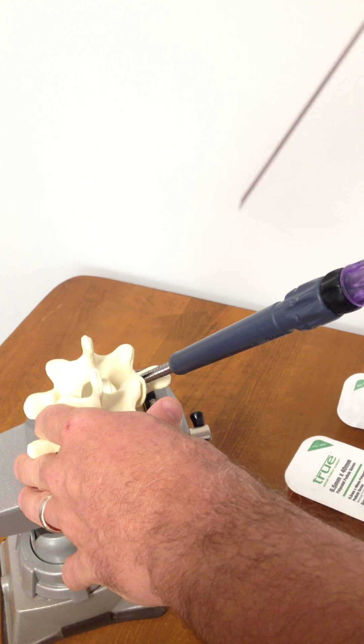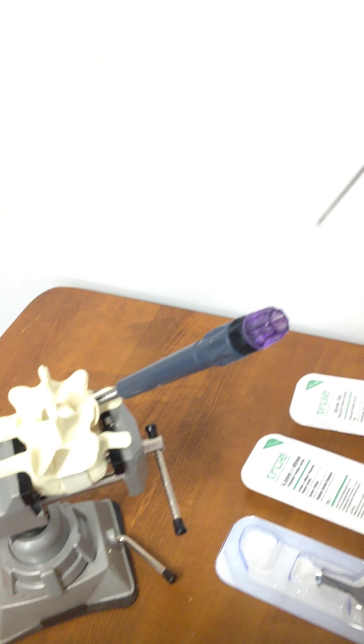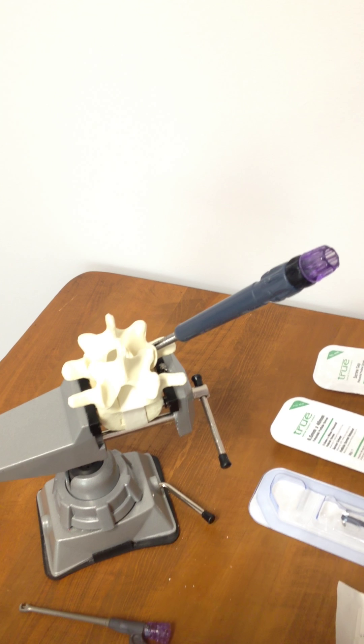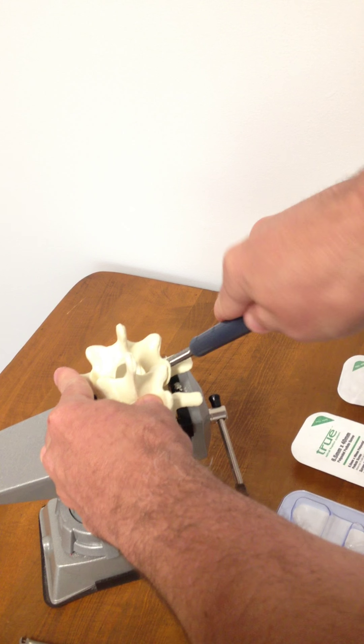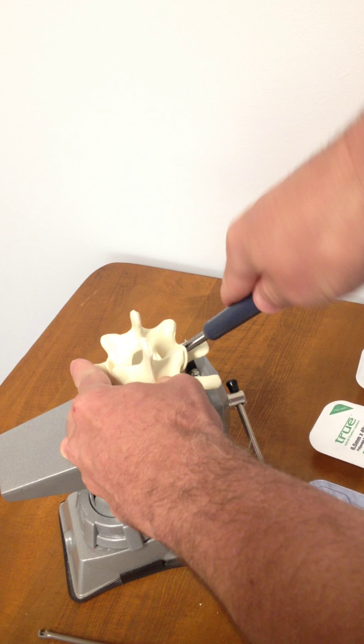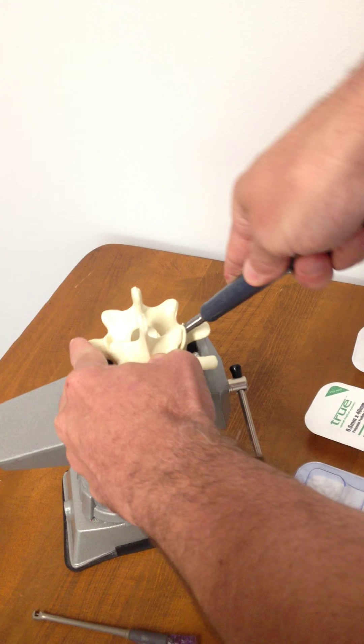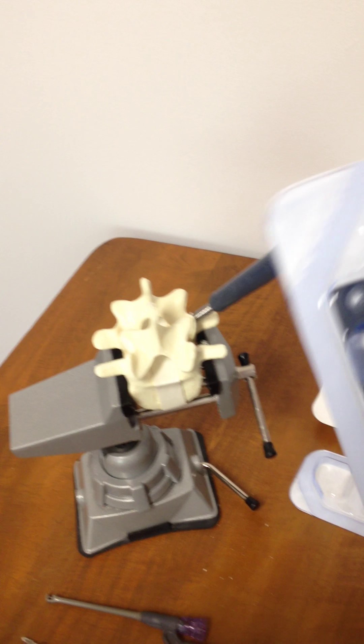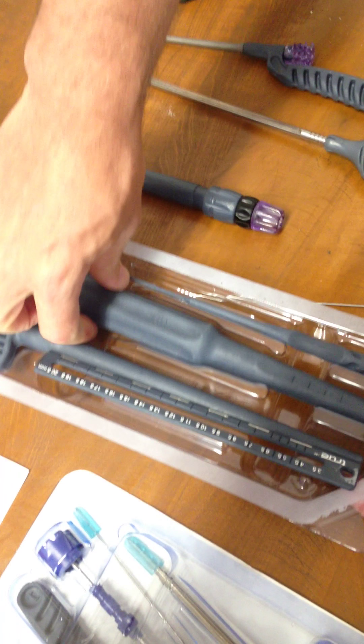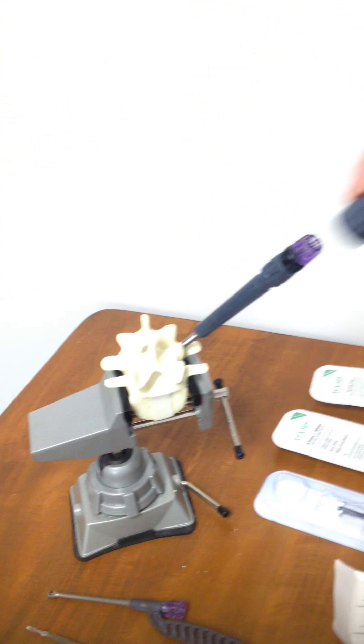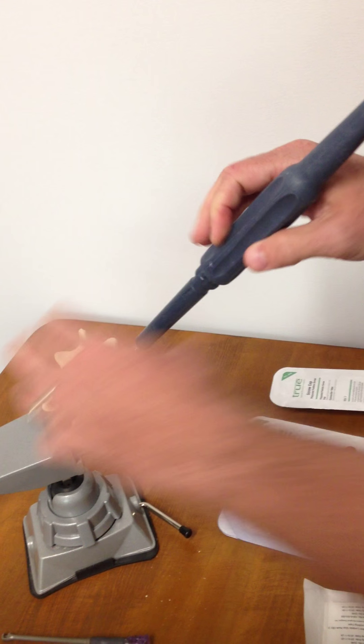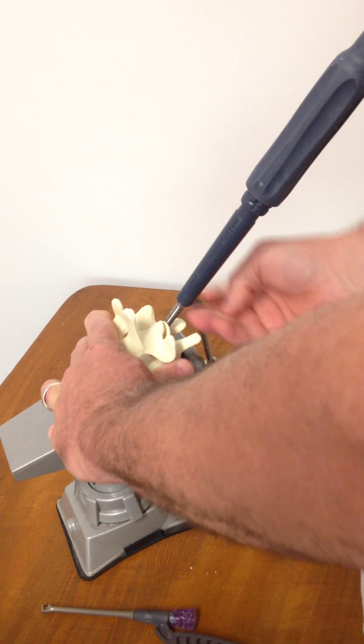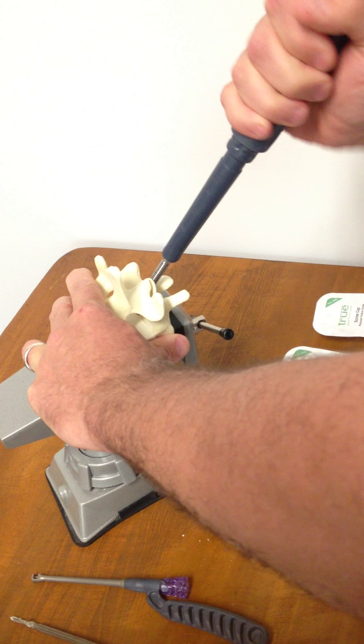And then the guide wire comes back out, and that allows for final screw placement. I'm going to go ahead and open up the convenience kit here and put our torque handle on to allow for full delivery of the screw.